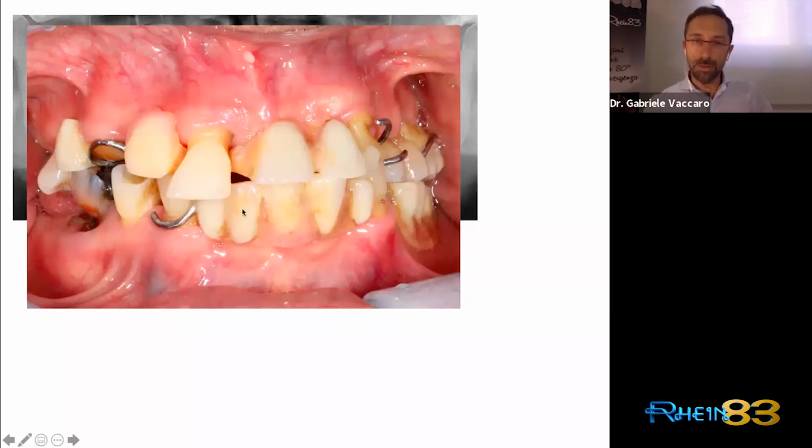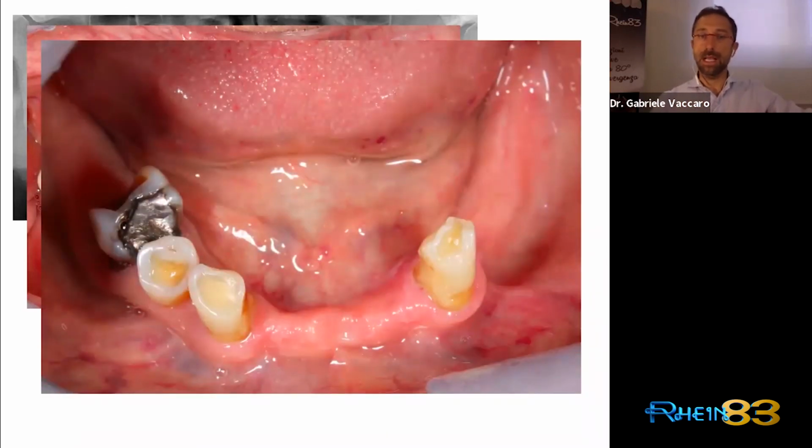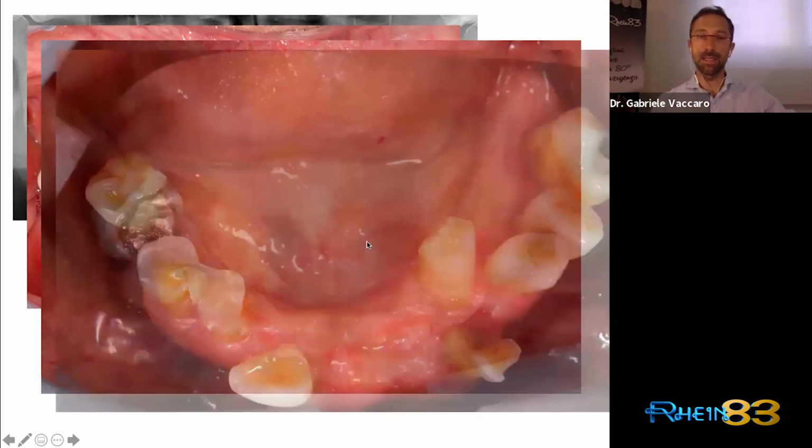But for sure, we have a different material in the occlusal plane. So we have natural teeth against resin, like here, and here, and here. So the occlusal plane is completely lost, because somewhere the tooth completely wore out the resin, but not in the same way. The diagnosis must be updated now with the new knowledge that we have. So these 3 teeth, 2 canines and 1 premolar, can be used again in a good way.